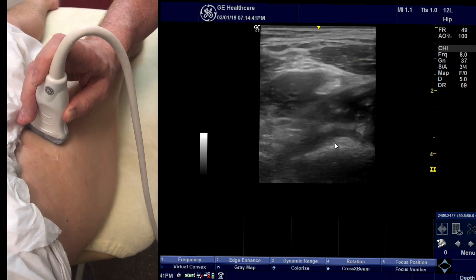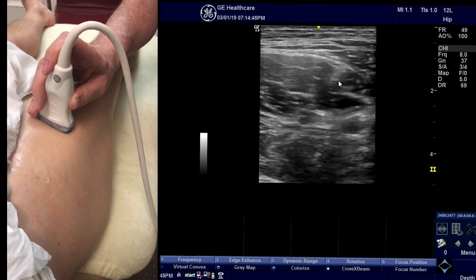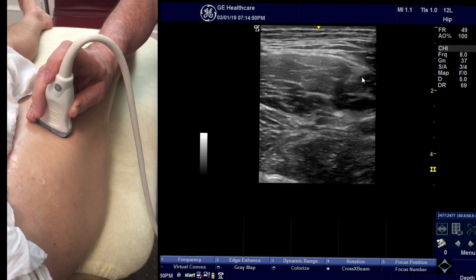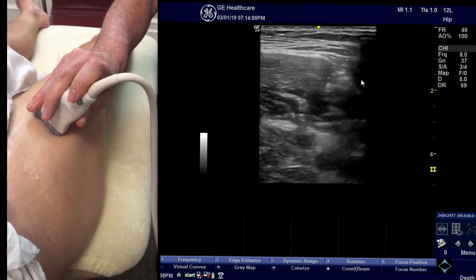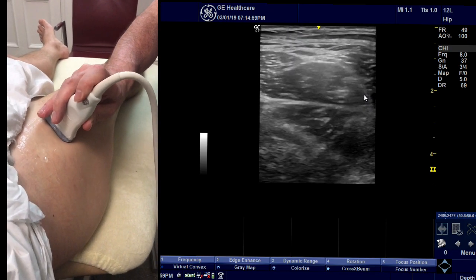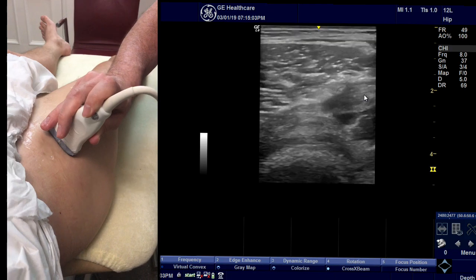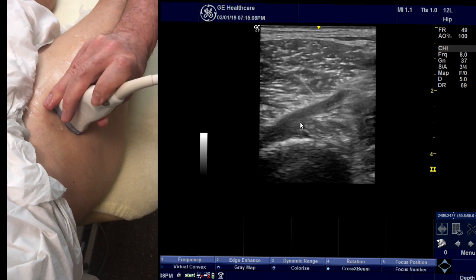You come back out, move the direct head to the right side of the screen, and dig the lateral side of the probe into the patient a little so you're coming at it from a slightly different section. Then you follow it up again and there you see the indirect head running across.